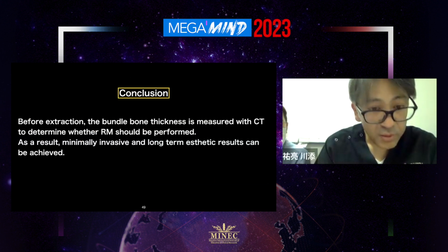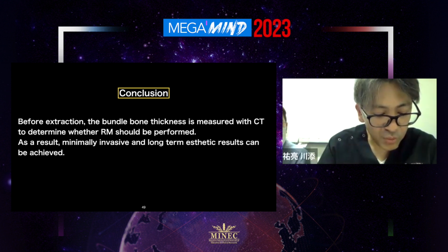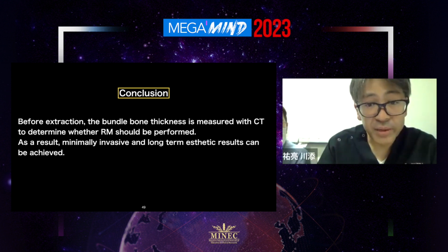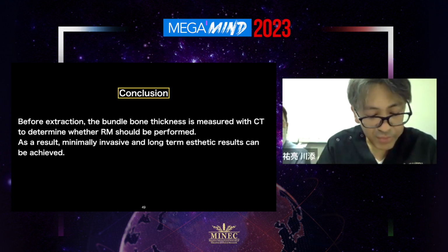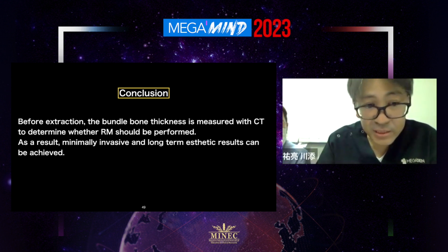Conclusion. Before extraction, the bundle bone thickness is measured with CT to determine whether root membrane should be performed. As a result, minimally invasive and long-term aesthetic results can be achieved.